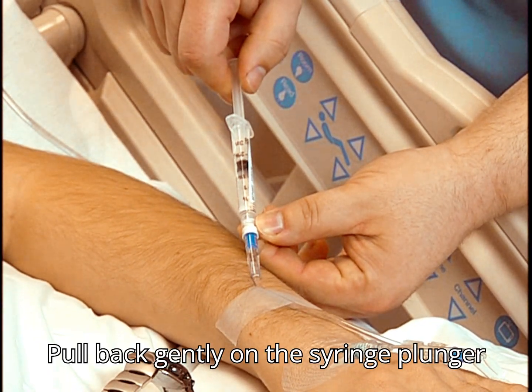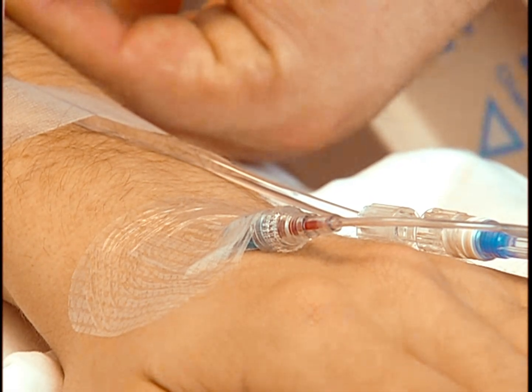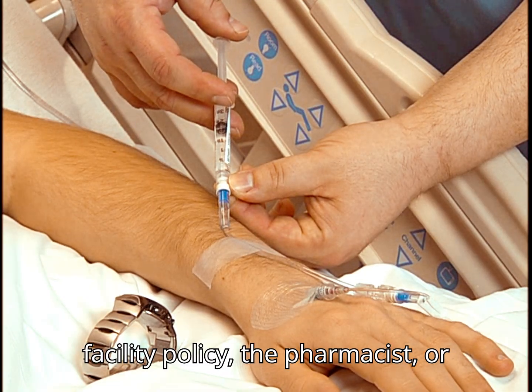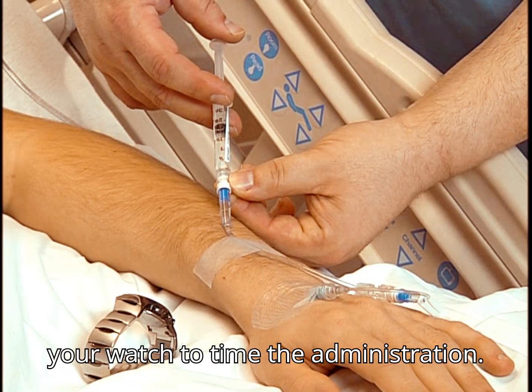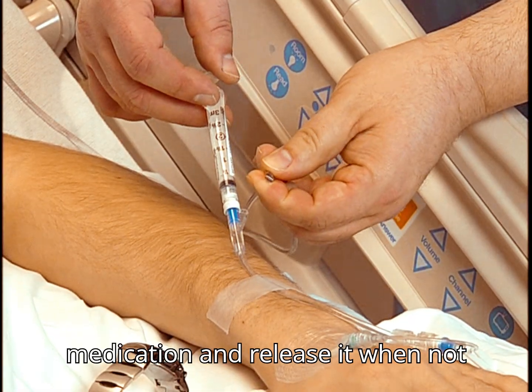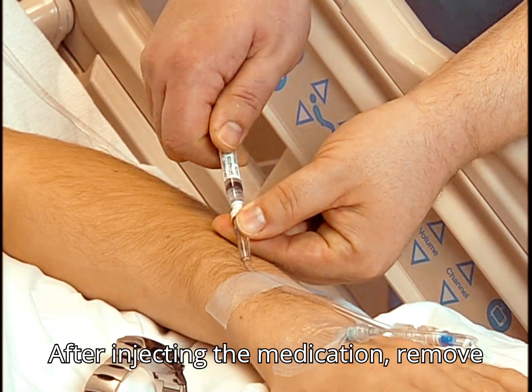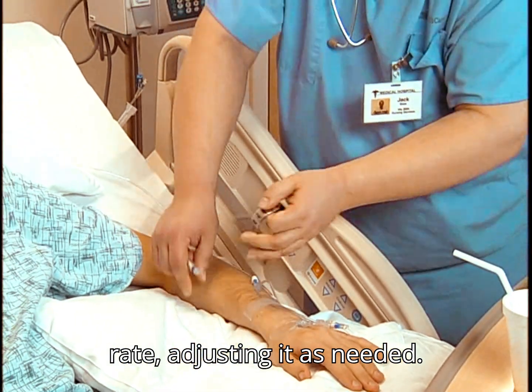Then insert the needleless tip of the medication syringe through the center of the port. Pull back gently on the syringe plunger to aspirate for a blood return. If the IV is patent, inject the medication over the time recommended by facility policy, the pharmacist, or a drug manual. Use your watch to time the administration. Pinch the IV line when pushing the medication and release it when not pushing to let the IV fluid infuse. After injecting the medication, remove the syringe and check the IV infusion rate, adjusting it as needed.